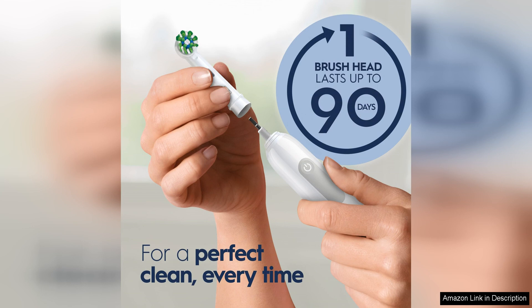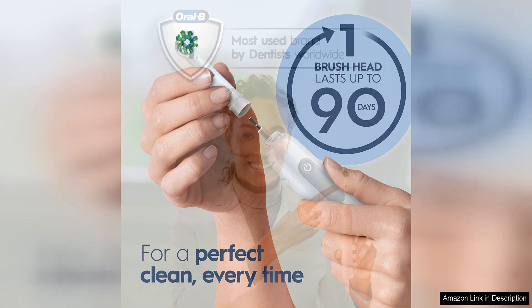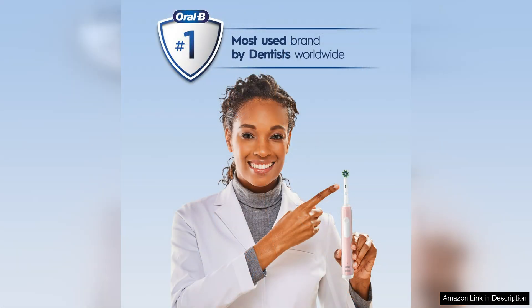The toothbrush comes with a rechargeable battery that lasts up to 7 days on a full charge, making it convenient for travel or everyday use. The slim and lightweight design of the brush also makes it comfortable to hold and maneuver while brushing.